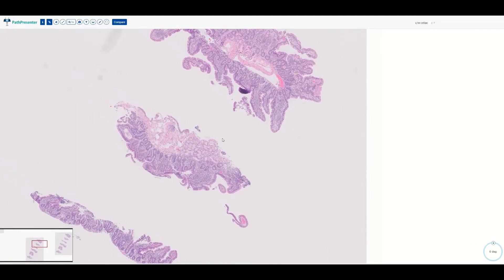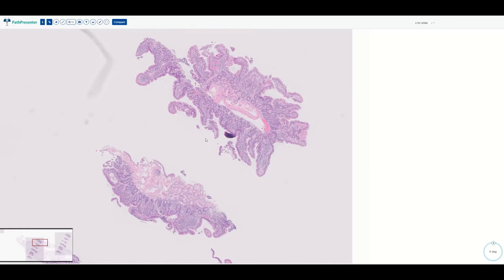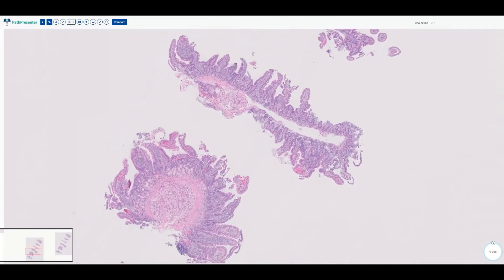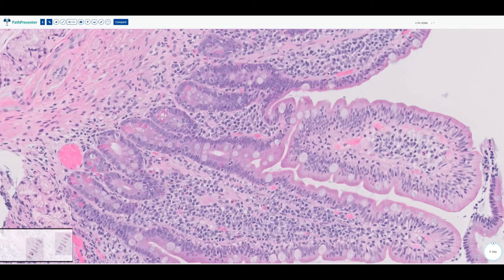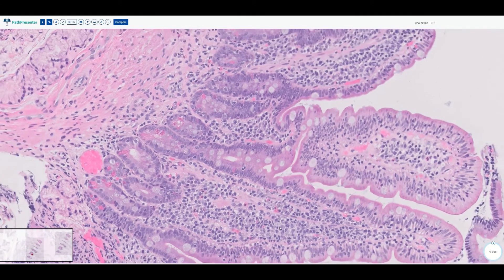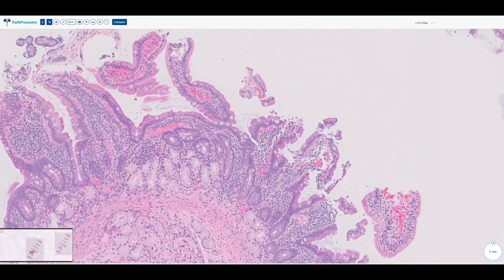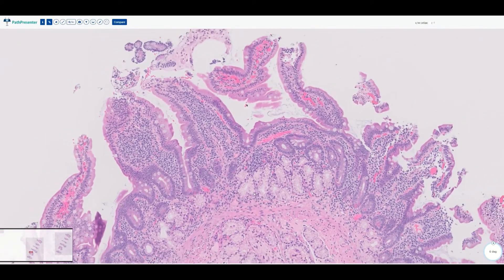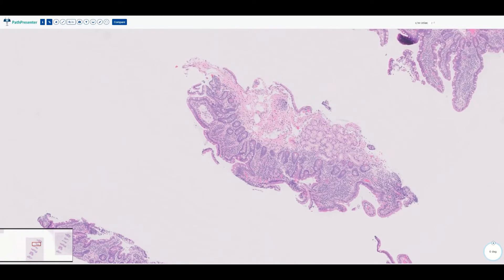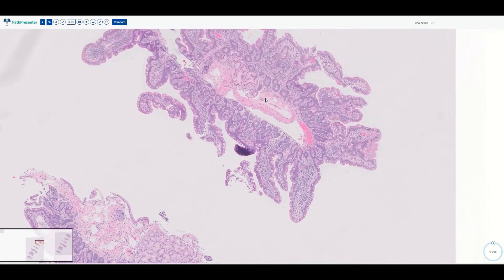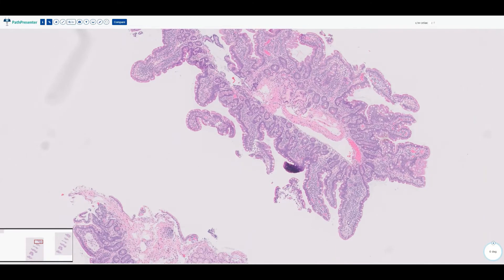Our next case is something that a lot of endoscopists ask us to look for. On low power, we can see the submucosal Brunner's glands — once again, we are in the duodenum. My first impression on low power is that the lamina propria is very busy, meaning it's kind of filled with inflammatory cells, mostly lymphocytes and plasma cells. Having plasma cells, lymphocytes, and occasional eosinophils in the lamina propria of the small bowel is normal, but here there's just a little too much.